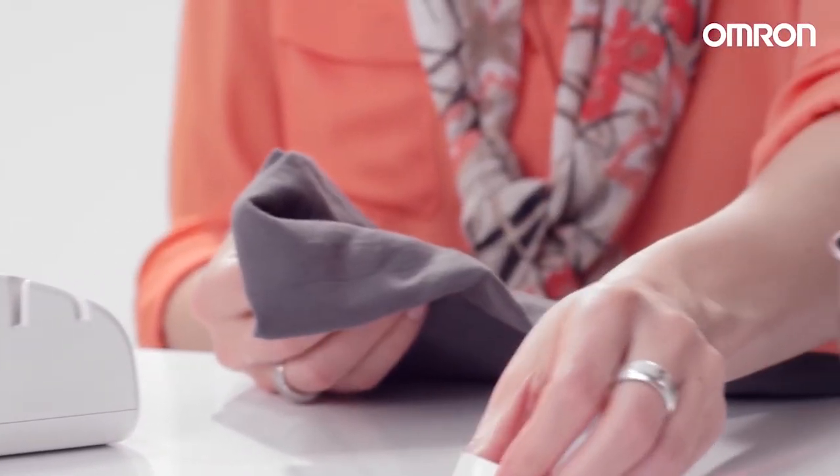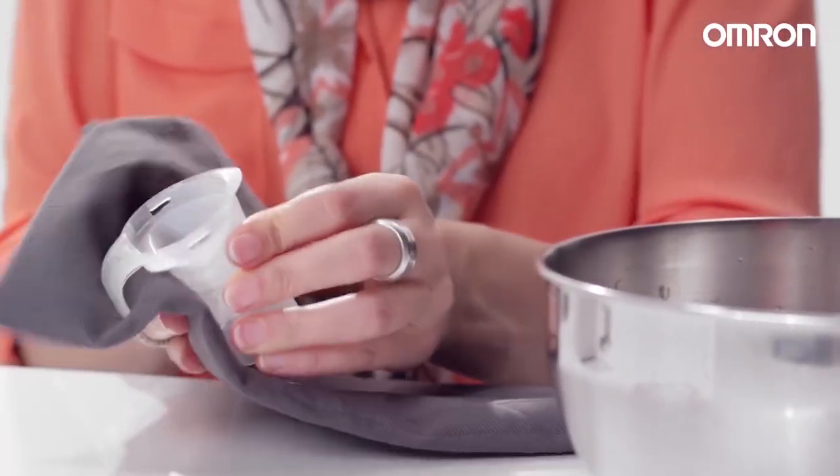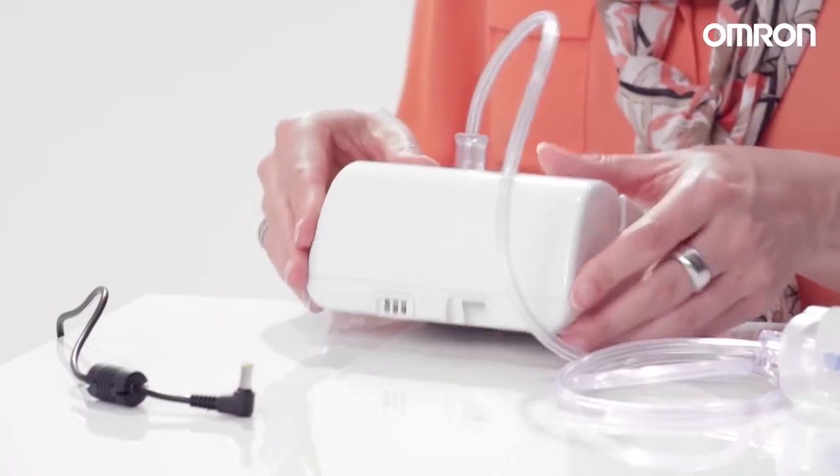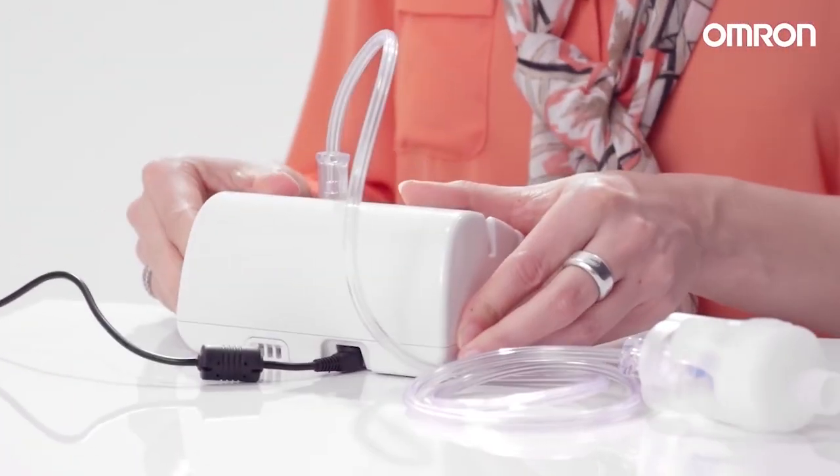Clean the nebulizer kit and all accessories with warm water before initial use or if not used for a long time. Insert the power plug of the AC adapter into the compressor and into a power outlet.